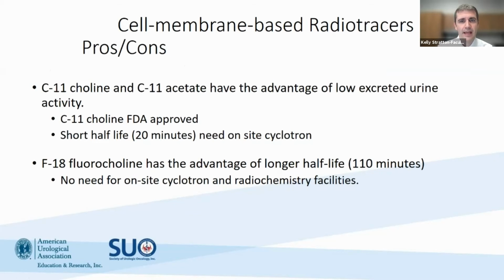So they do have the advantage of having low urinary excretion. And so for patients who have maybe a potential recurrence in the pelvis, that can be helpful. It is FDA approved, short half-life. There is also fluorocholine, which has the advantage of a longer half-life, so it doesn't need an on-site cyclotron. Again, it hasn't become as widely available.